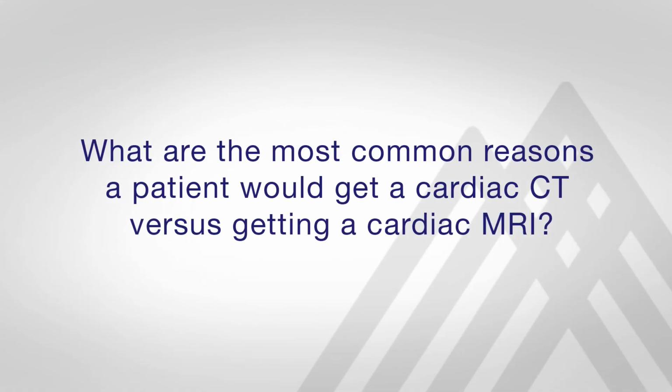On the other hand, cardiac MRI uses a powerful magnetic field, radio waves and a computer to produce those detailed images. And often this test is a lot longer, usually taking between 60 to 90 minutes, depending on the indication.